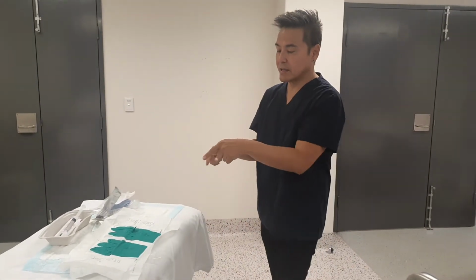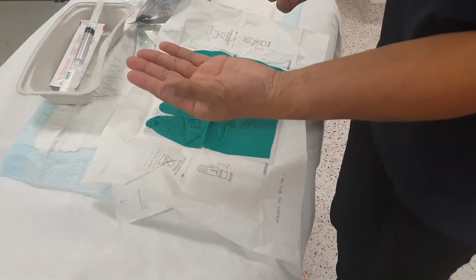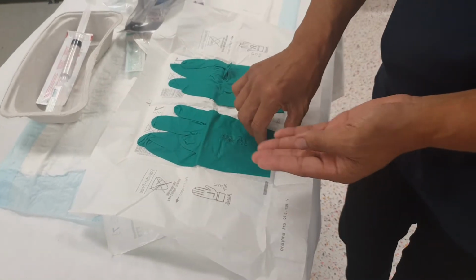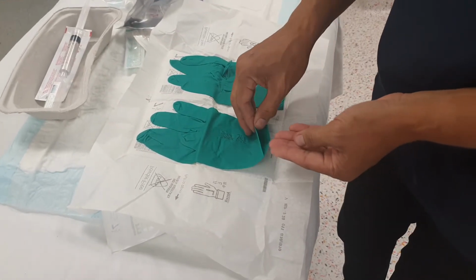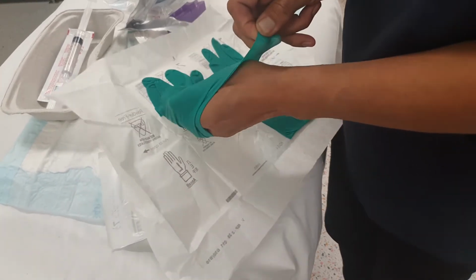Once I've dried my hands, I'm going to put my gloves on, okay? So the gloves are packed with the thumb like this. So when I approach my gloves, I'm going to bring my thumb in just to try to find that thumb hole, making sure that I don't contaminate my hands.